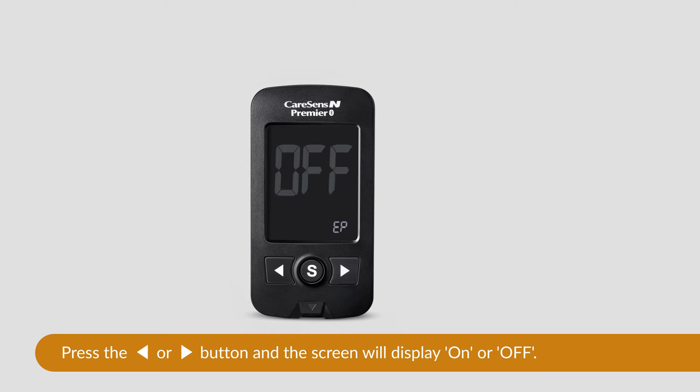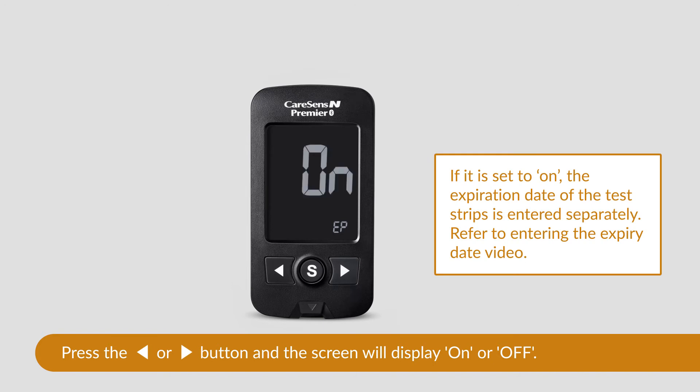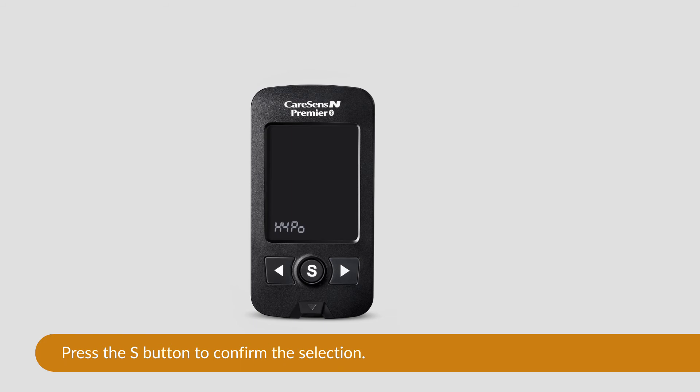Press either of the arrow buttons and the screen will display on or off. If it is set to on, you are required to enter the expiration date of the test strips separately. Refer to the entering the expiry date video. Press the S button to confirm the selection and go to the next step.